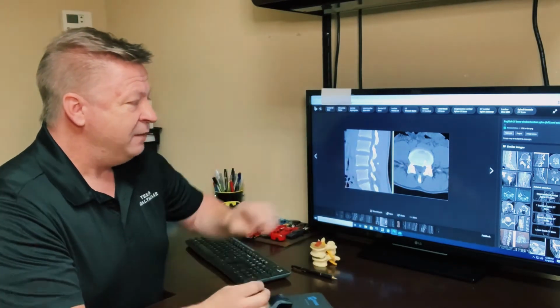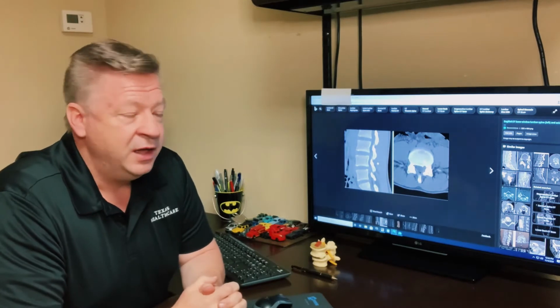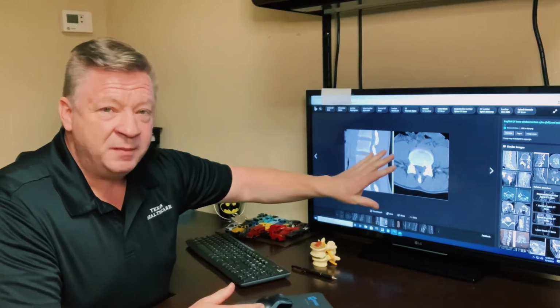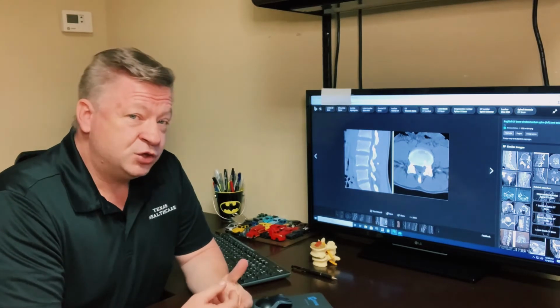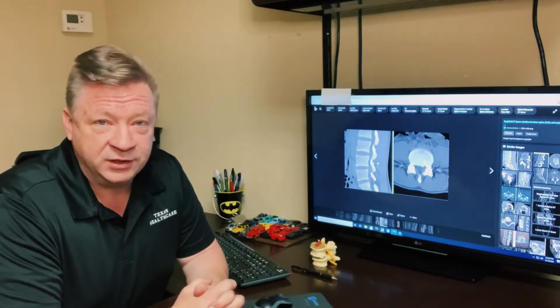It is the very best way to find little tiny fractures that you might not be able to see on an x-ray. It can also show a number of other things around the vertebra and some inflammation, so it's a very, very valuable test. An x-ray or a CAT scan is the primary thing that a hospital will use on an injury initially.